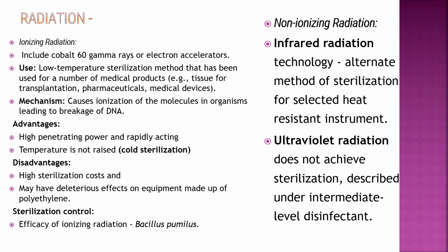Advantage: high penetrating power and rapidly acting. Temperature is not raised, so it is also called cold sterilization. Disadvantage: high sterilization cost, and it may have a deleterious effect on equipment made of polyethylene. Sterilization control: efficacy of ionizing radiation is checked by Bacillus pumilus.